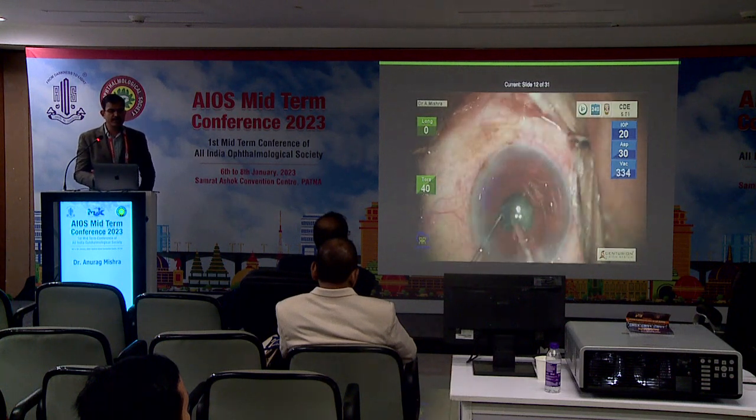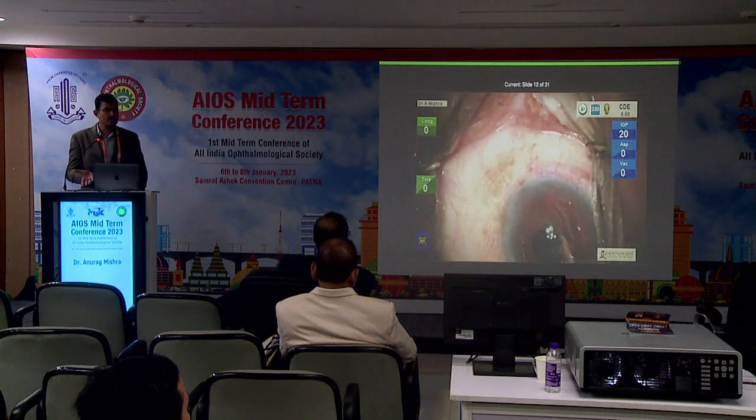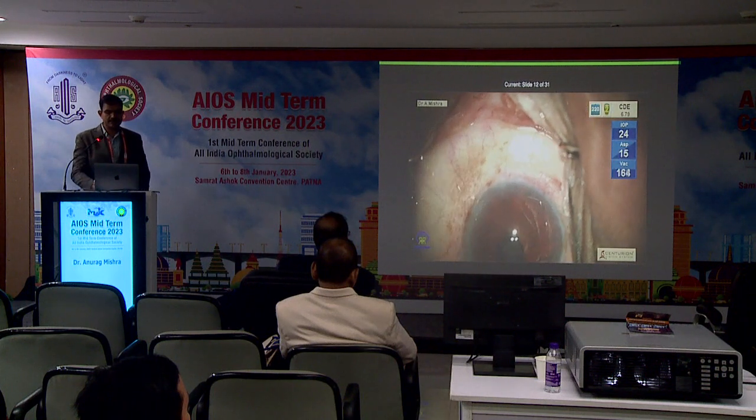This is an unedited video, just been sped up in the interest of time, and you can see how quickly it has finished off all the pieces, and while the needle is right at the center.